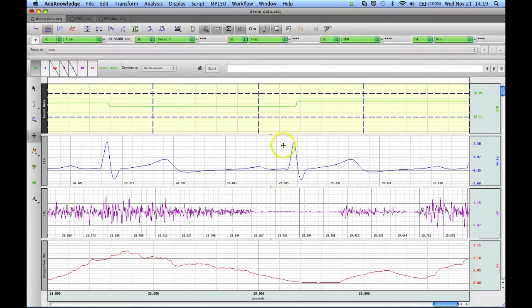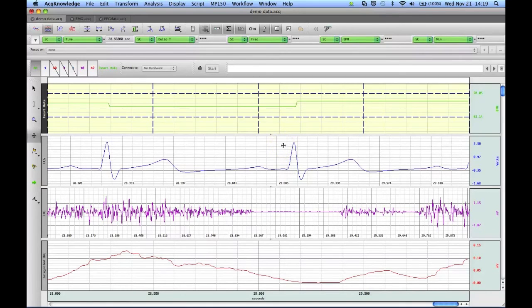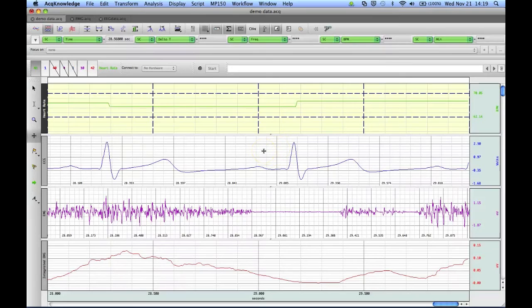on certain channels, the Grid Tool shows both a vertical and a horizontal icon. This is because the horizontal and vertical are not locked on that channel.